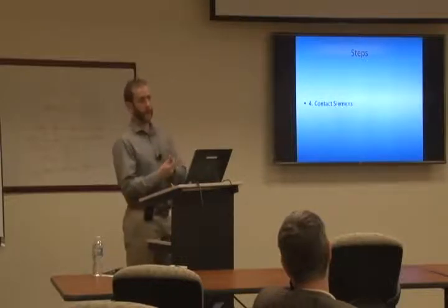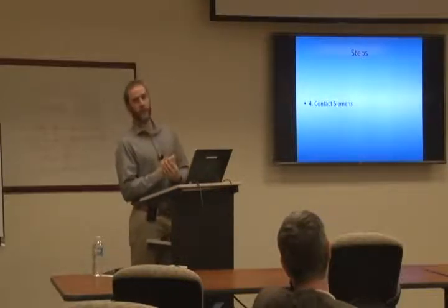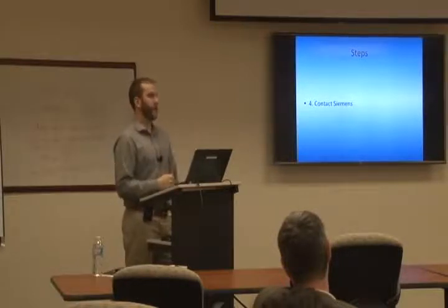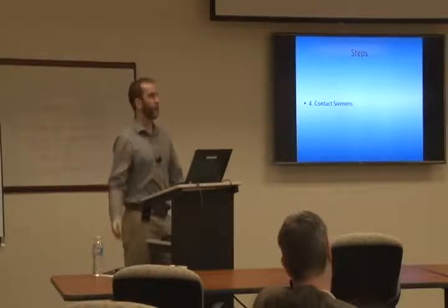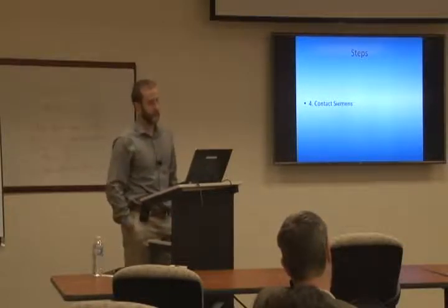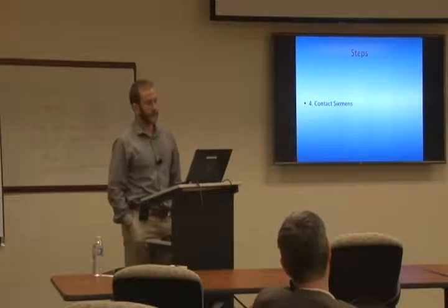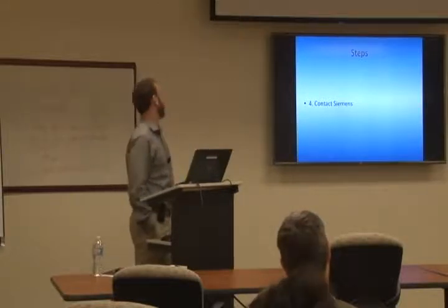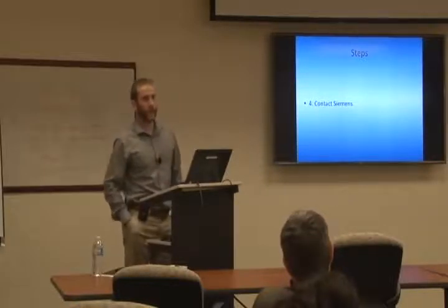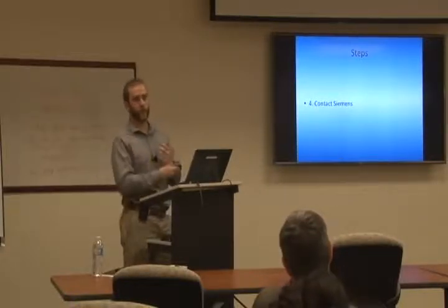Then you contact Siemens, and I know it's kind of a nuisance sometimes to contact Siemens and say, hey, we got this, they're willing to give it to us, what paperwork do we have to do? Sometimes it takes a couple of weeks. They're fairly efficient with it still, but it can really be a nuisance. But it's a good nuisance, because developers are a lot more keen to give you their sequence when they know they're protected by all this paperwork.